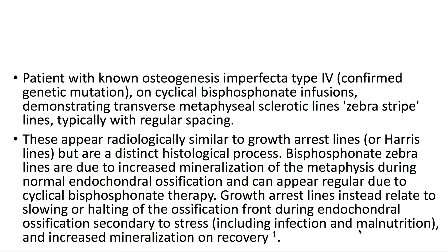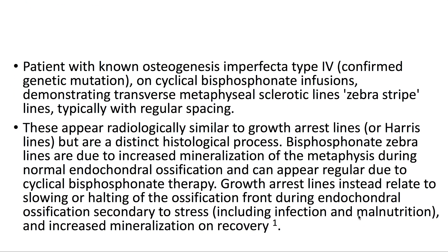This is a patient with known osteogenesis imperfecta type 4 on cyclical bisphosphonate infusions, demonstrating transverse metaphyseal sclerotic lines, or zebra-stripe lines, typically with regular spacing.